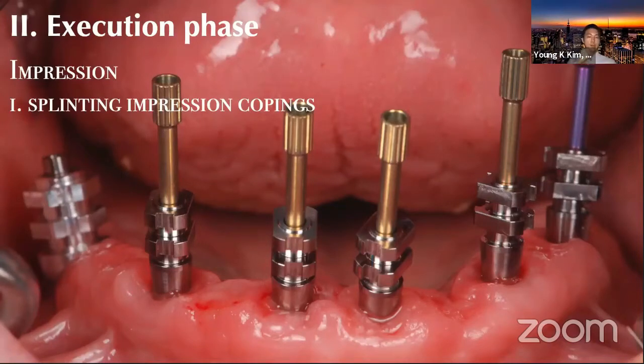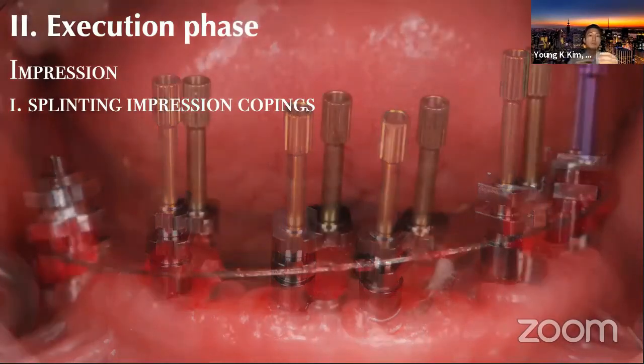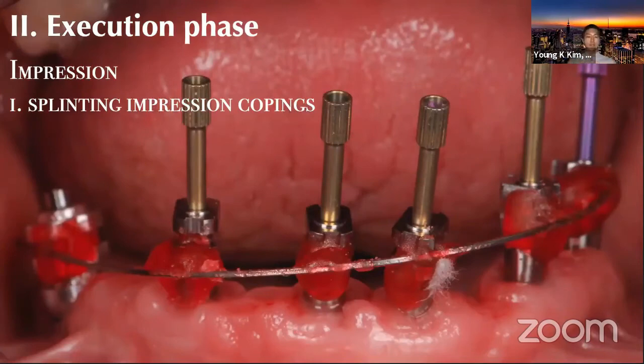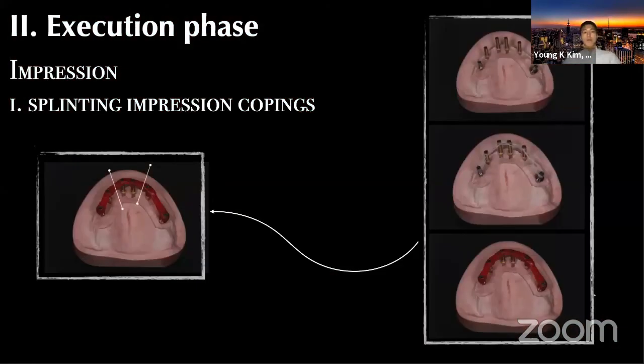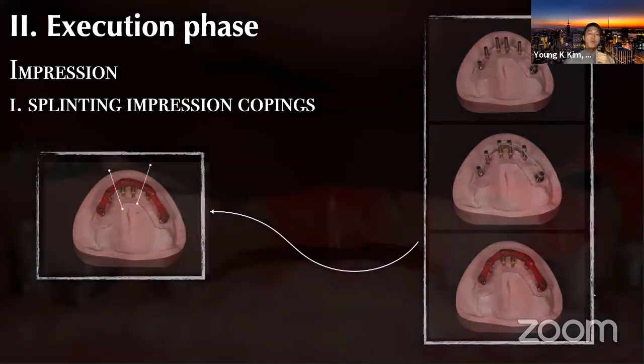So in this case, I was questioning the angulation. I didn't place the implant, so I didn't know the angulation information. You can choose to use the closed tray impression technique and do the exact same procedure, but I did the open tray impression technique with ortho wire in it, flexible ortho wire, but rigid at the same time. A little bit of salt and pepper on the pattern resin, and then you take the impression with it. And what you do is perform the passivity test extraorally, in the laboratory setting, and see if you can get passivity in the different sections, and then you figure out where there is passivity and where there is no passivity. And then ultimately what you want to do is check that passivity.